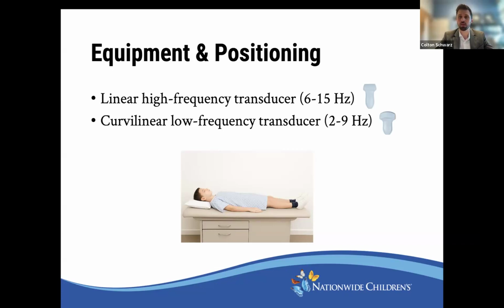I'll say that this tends to be a more sensitive exam, especially for kids. So just making sure that you're being considerate and getting them as comfortable and covered as possible. One method you could do is getting them into a gown and using some towels to cover their genitals or any other skin surface not needed for scanning. Other people like to use paper shorts and cut them up, which is totally fine too.